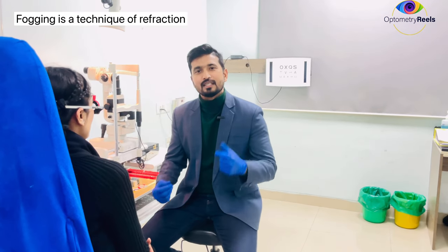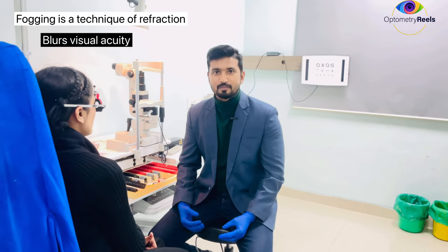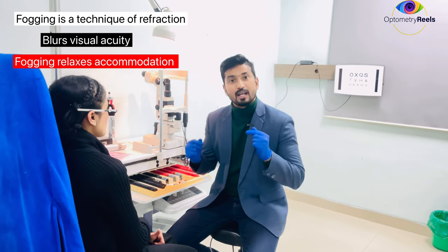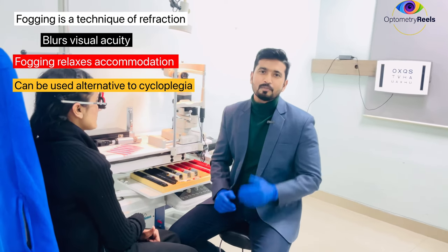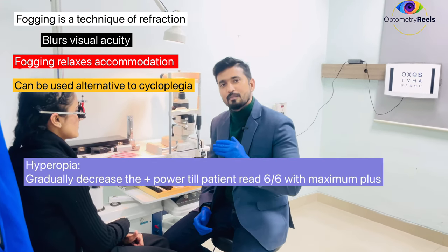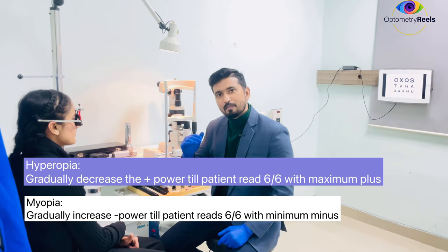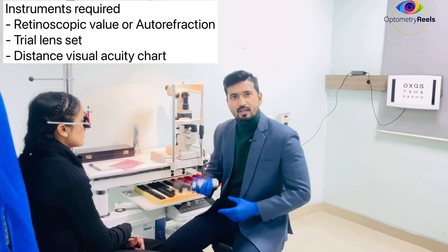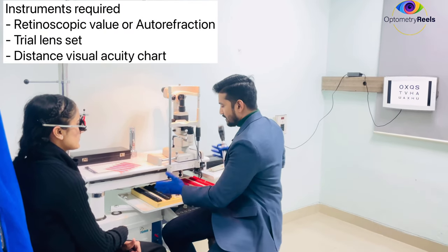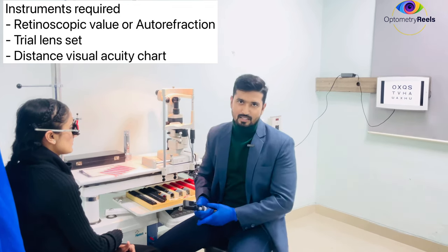Fogging is a technique used in refraction to blur the distance target by using plus lenses over the retinoscopic values. Fogging is done to relax the accommodation. For hyperopes it is mainly done from high plus to low plus, and for myopes it is done from low minus to high minus. The three prerequisites for fogging are retinoscopy, a trial lens set, and a distance visual acuity chart.